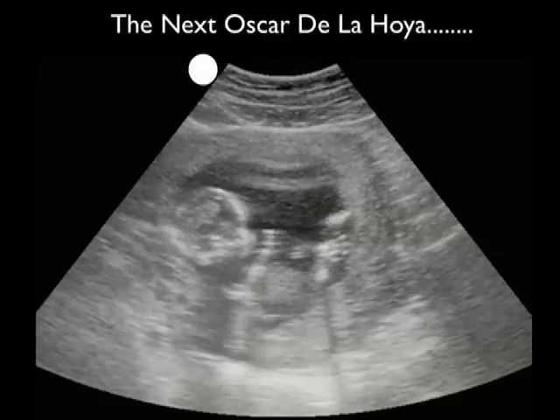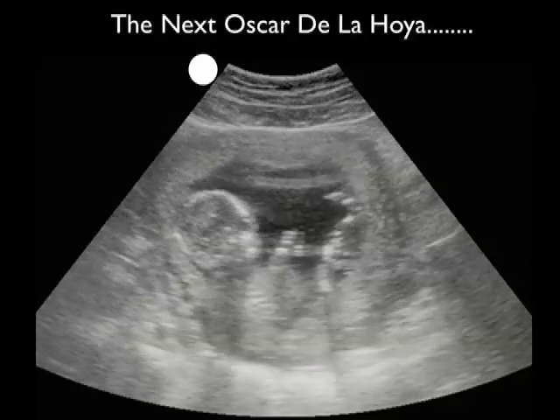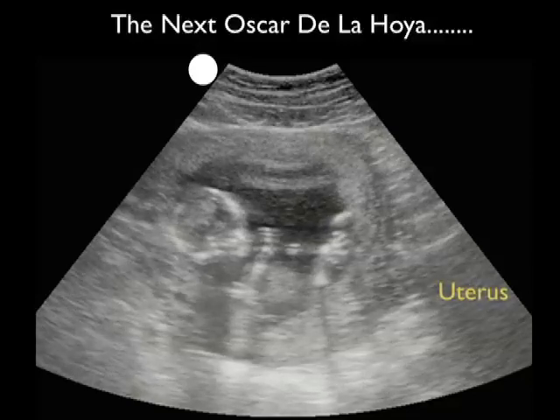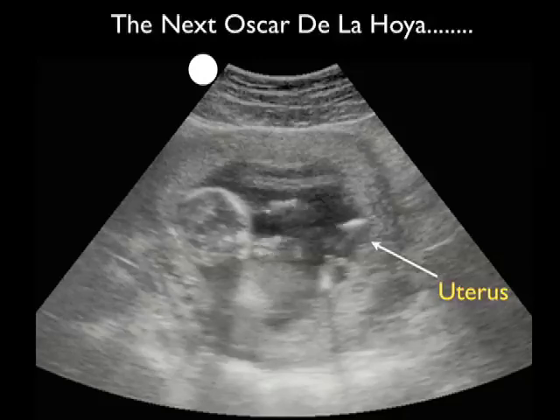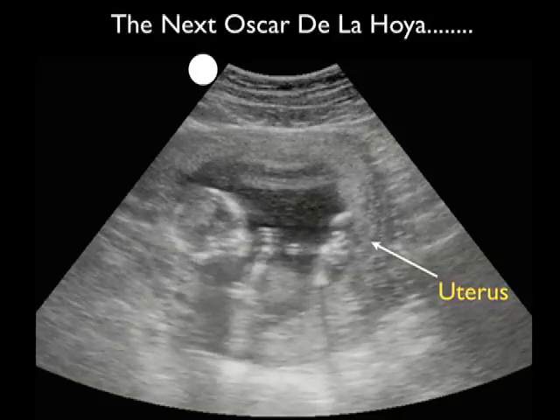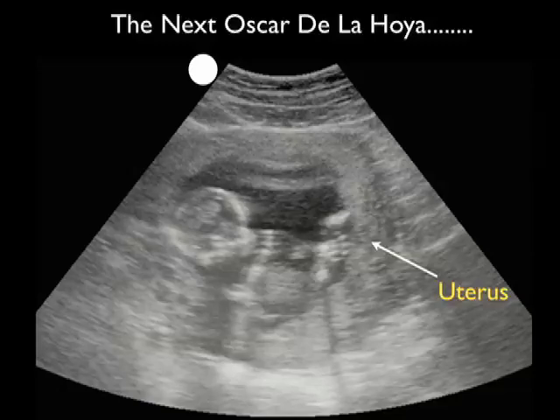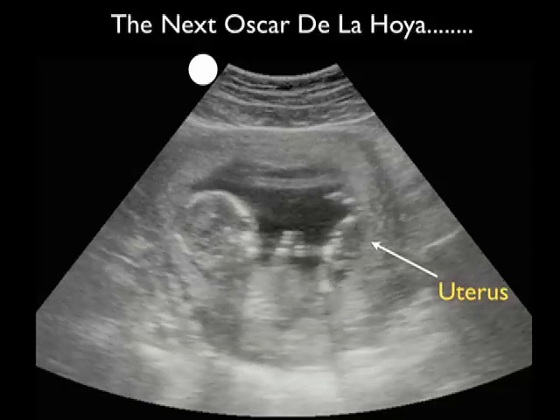Here's an early second trimester pregnancy. We see an active baby — note the mean right hook. The important finding here is that this is confirmed as an intrauterine pregnancy, as we can define a good mantle of uterus surrounding the pregnancy. This is very important, as some ectopics can grow to an advanced age but are discerned by a lack of uterus around the pregnancy.